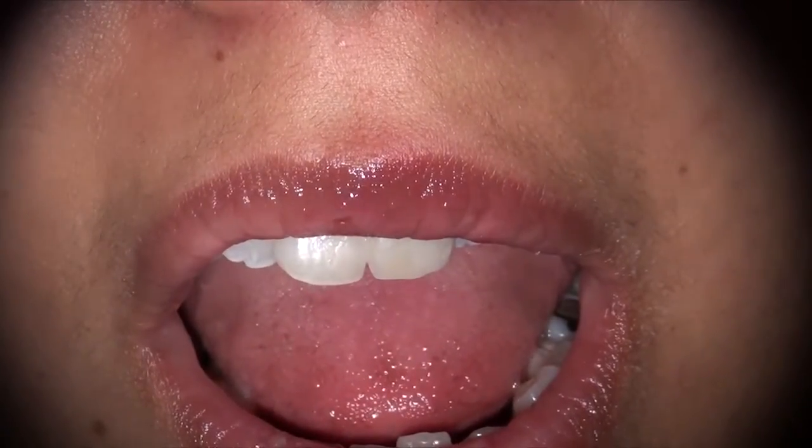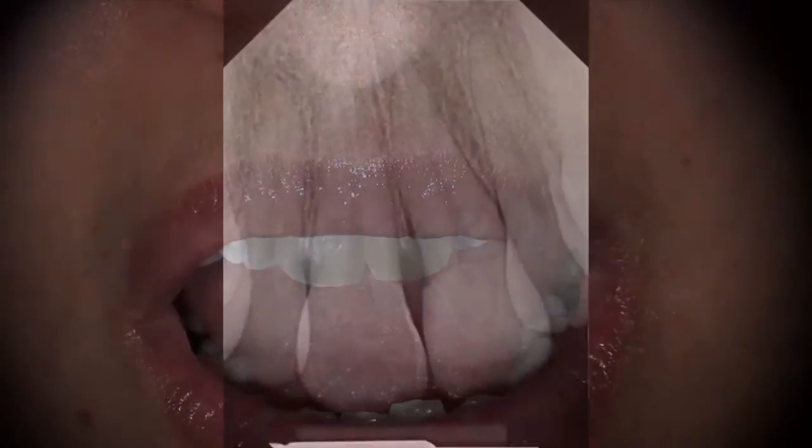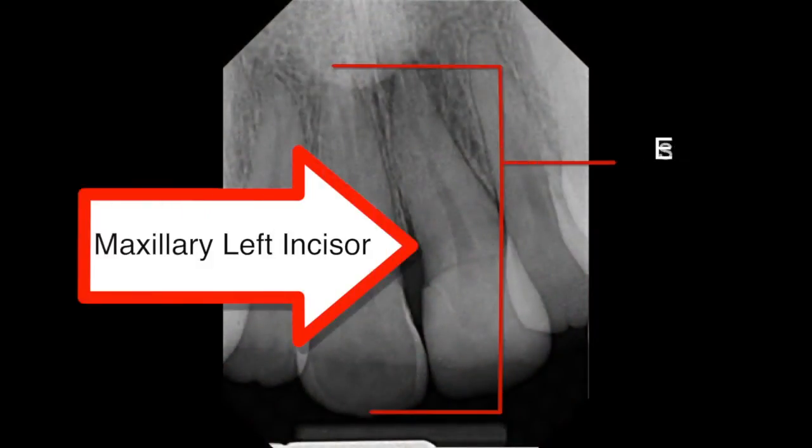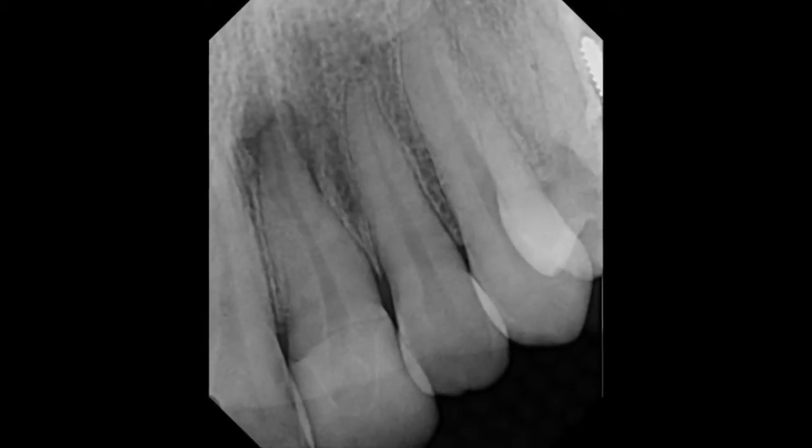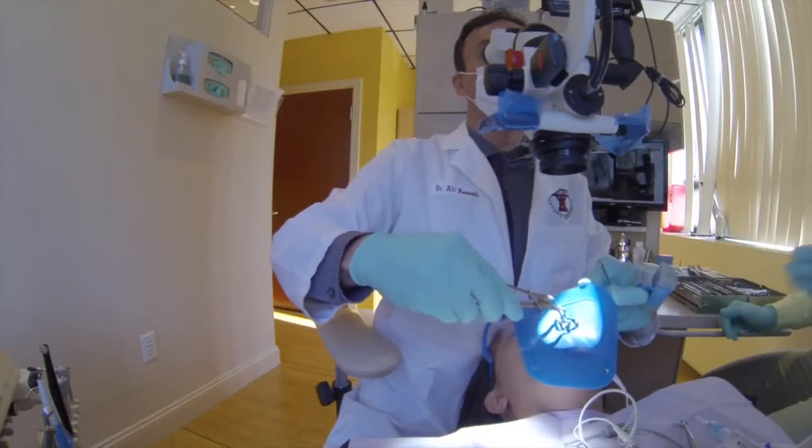Let's take a quick look at this anterior central incisor on the left side of this patient. It requires root canal therapy due to necrosis and a peripheral infection. As usual, what we always do is we determine the estimated working length, and in this tooth it is 22 millimeters. This is the maxillary left central incisor — you can see the lesion here. And we then place the rubber dam.